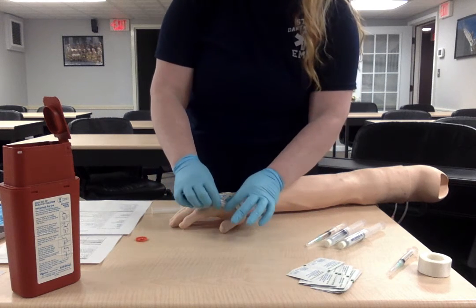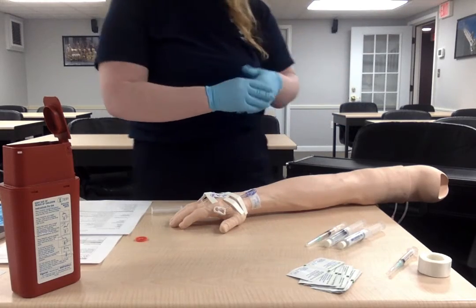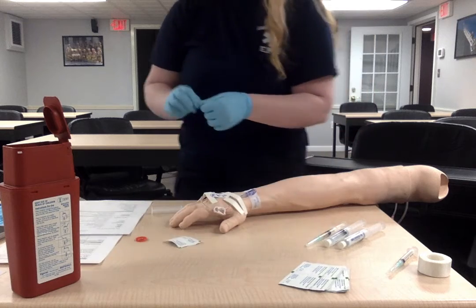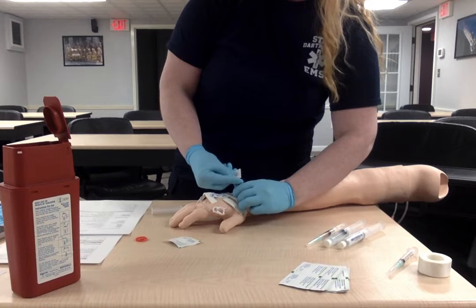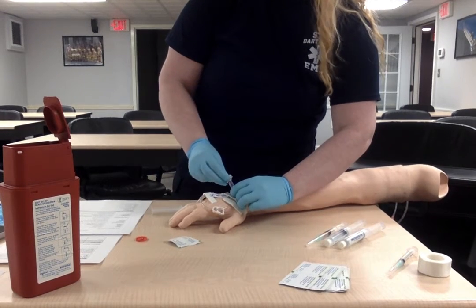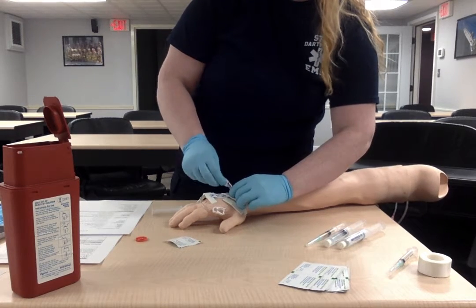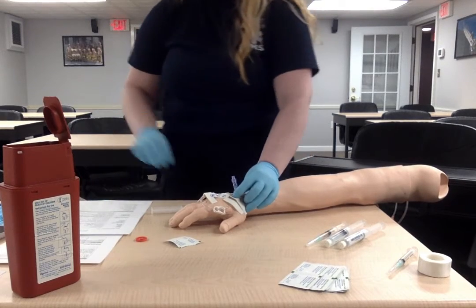So we can come over to the IV, we can unclamp this. If fluids were running, we would discontinue it at this time. We're going to take our alcohol prep pad, and we're going to take the port and wipe around this, all the threads, typically for about a minute. So we're going to continue doing that for just about a minute. Let it air dry. Don't let anything touch it.